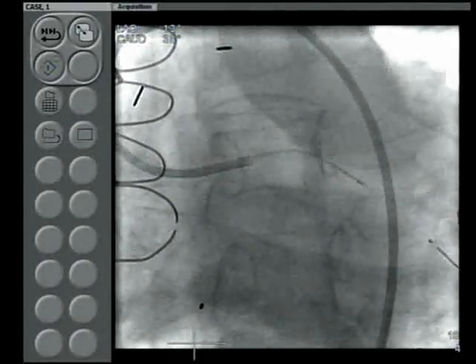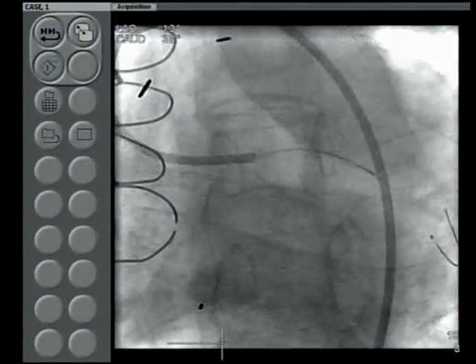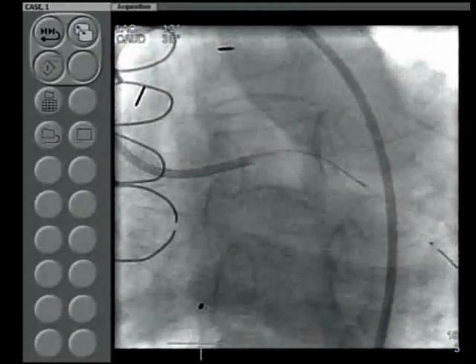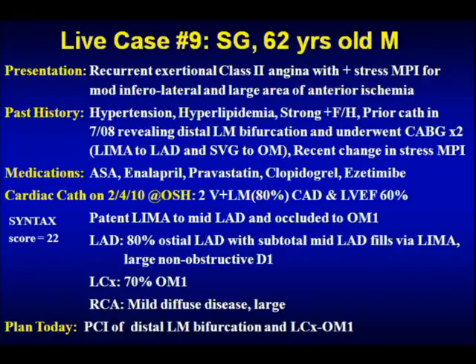Is it? Are we showing the circumflex? No, we just need to capture the ultrasound images a little better, and we'll have that in a moment. Okay, we'll keep playing it. Now, can you see it? Yes, we can see it. Not in as good a resolution as we would like to, but some speck of calcification there in the. Yeah, this is But we are going to let it play again. Okay, now we are going. For some reason, the camera person there will have to focus a little better on the IVUS image. But Samin, please go ahead.